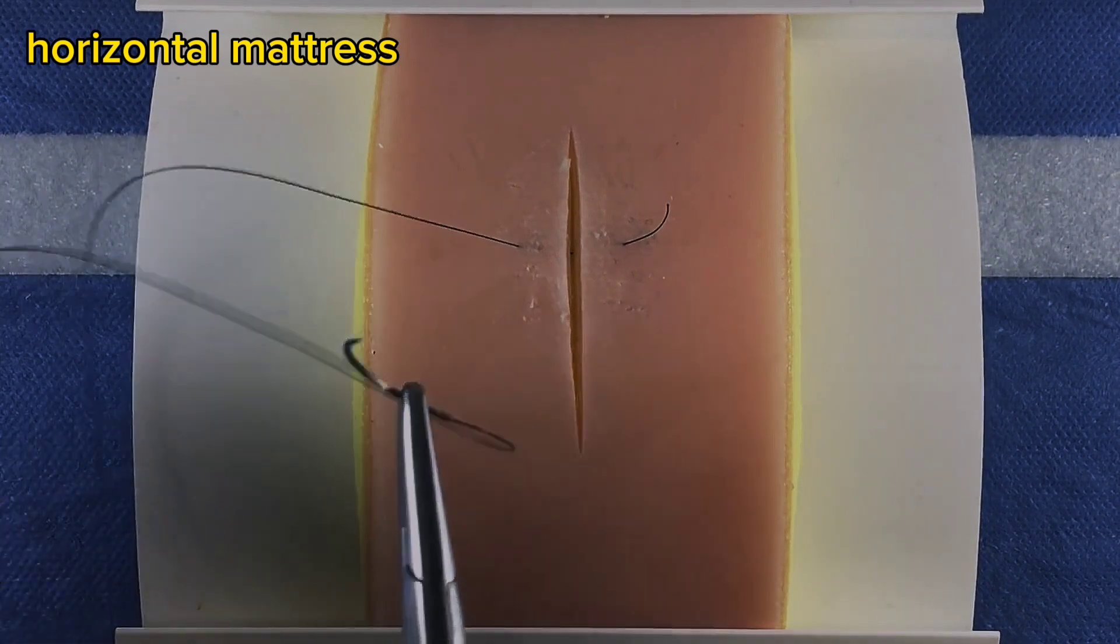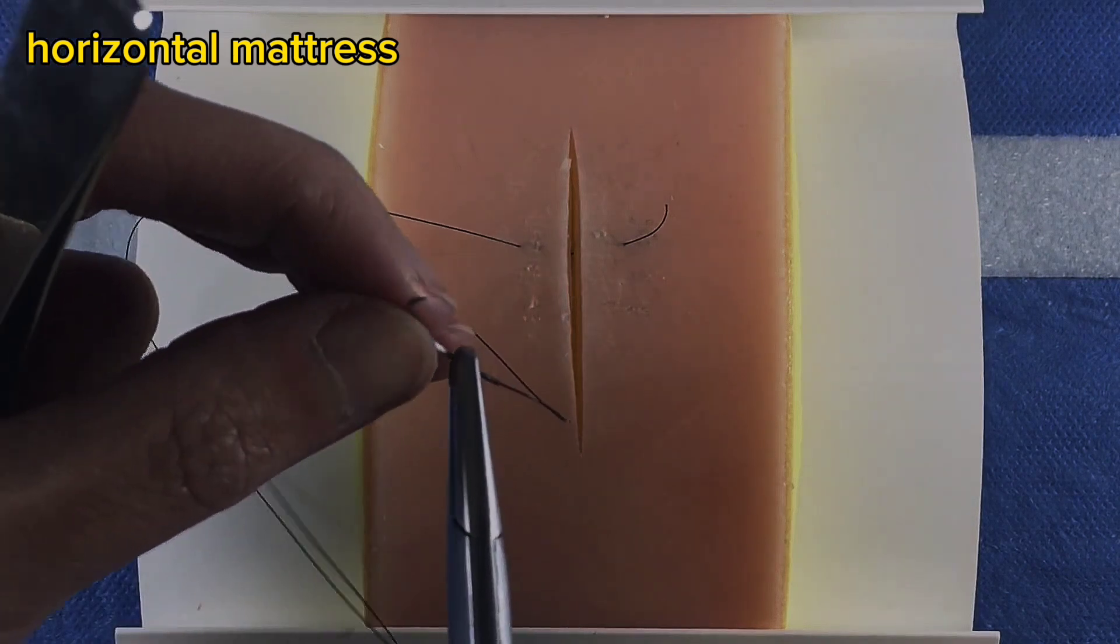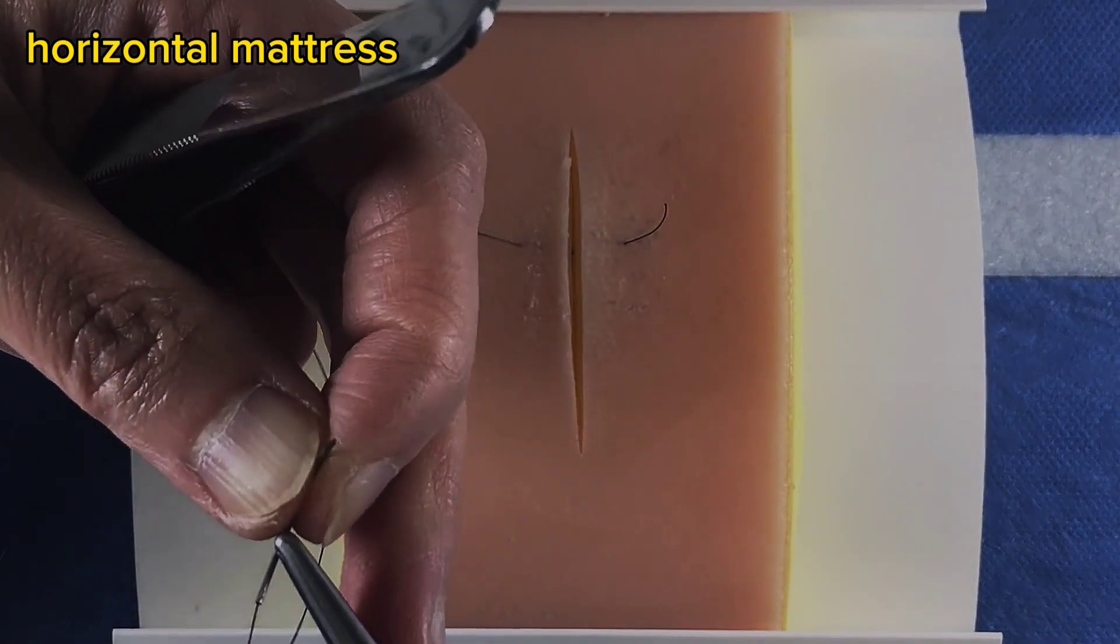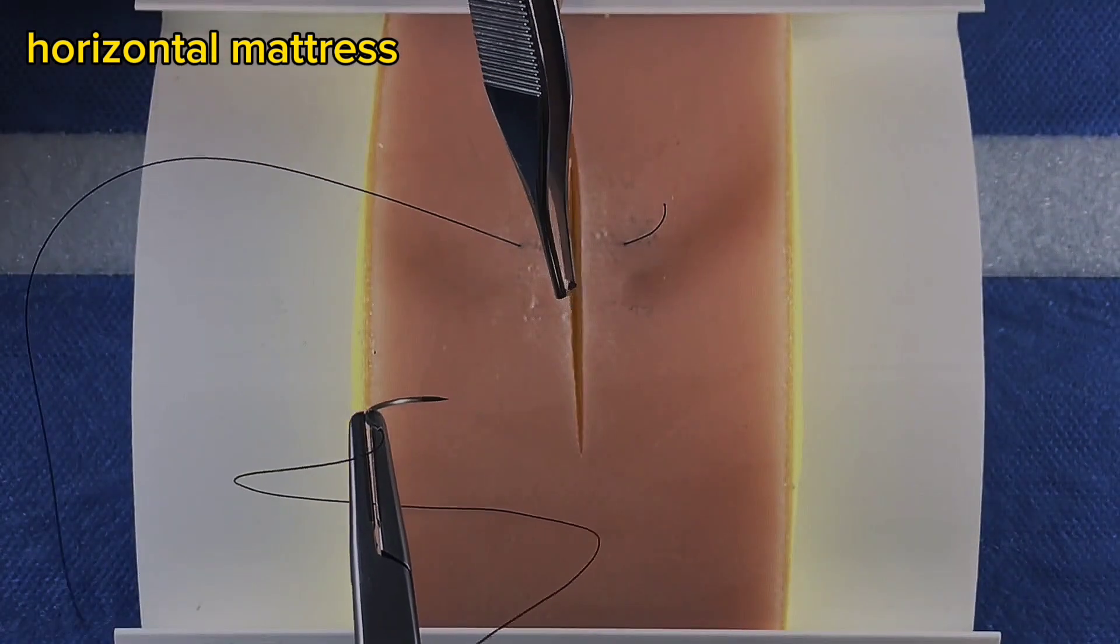Then, reload the needle. This is often done backhand. However, you may drive the next bite forehand if you have room to adjust and reposition your body.